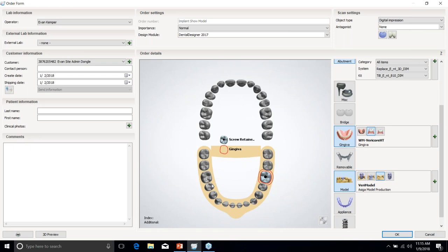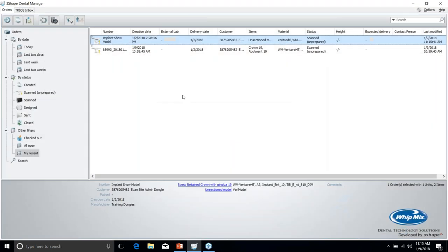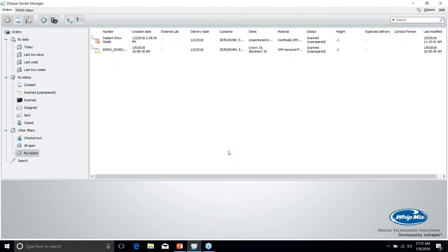If you were doing a bridge, then you would pick a tooth that's close to each one of your implant locations, set them up just like I have here as screw retained crowns with gingiva, and then anything in between, you select as pontic. So now we can go into the design.